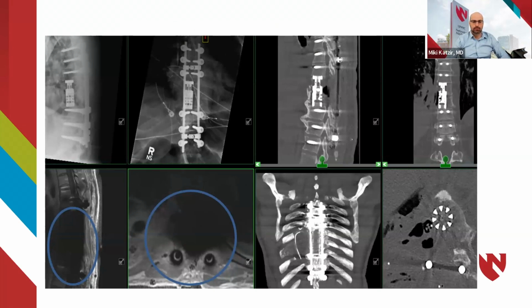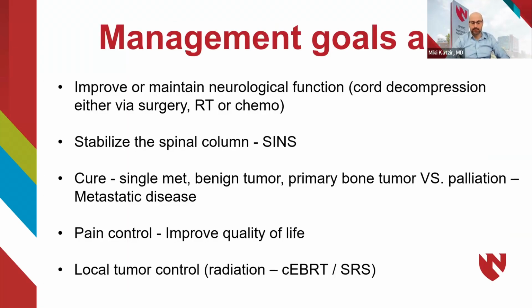So just kind of background and recap of what we did so far. With today's technologies, we can take apart the spine and put it back together, like this 2-cage corpectomy for tumor. And then we perform the post-op MRI, and that's what we see on the left-hand side on the bottom. A lot of artifact, we can't see anything. Is there any better option?